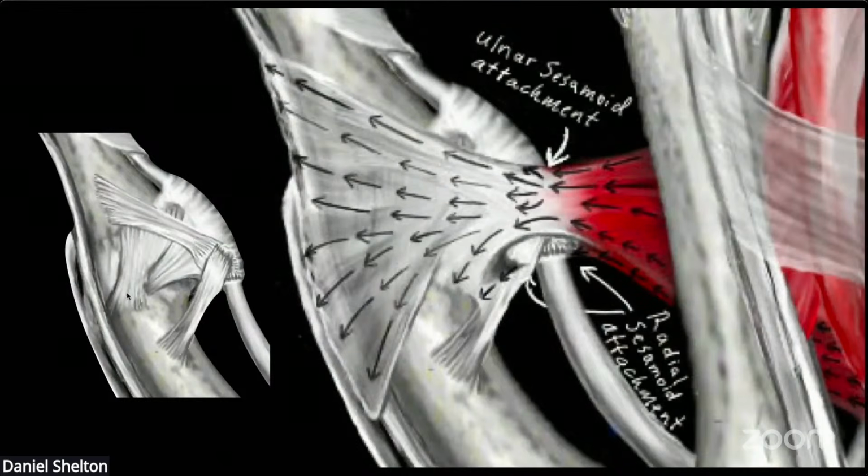So why does that matter? If you end up with a tear of the ulnar collateral ligament of the thumb and it protrudes through this network of fibers, then surgical intervention is required. You have what's called a Stener's lesion. If this ligament ruptures and the tear stays beneath these fibers, then you've got an isolated ulnar collateral ligament and probably a few more options of treatment.